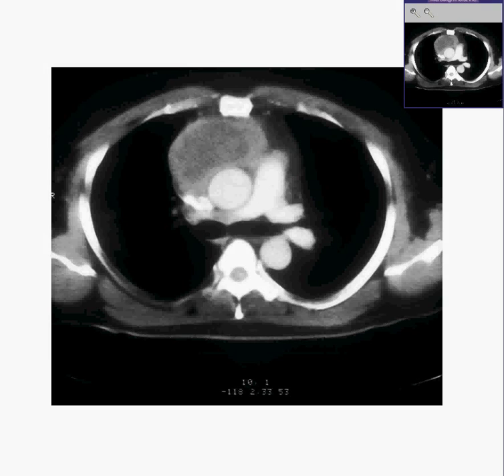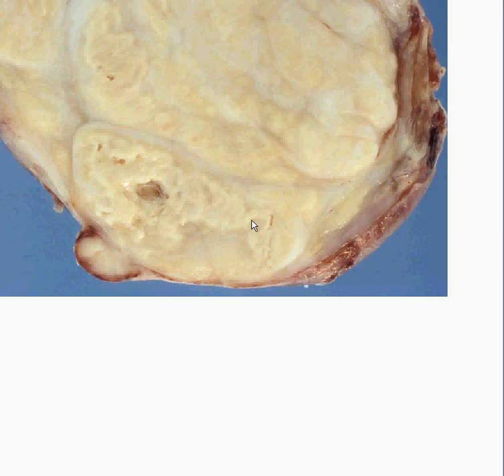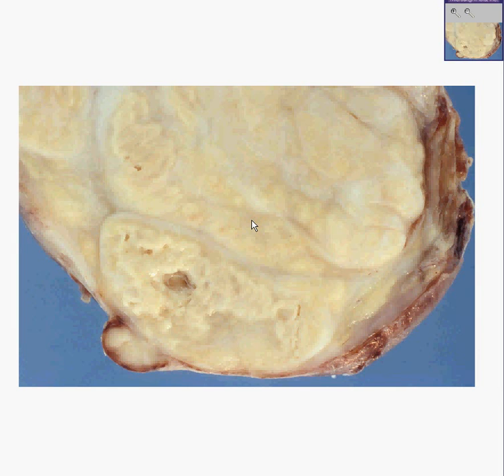Let's take a look at these lymph nodes grossly. We did the surgery, we cut through the lymph node, and look at the two obvious features of this lymph node. It has these nodules, and the nodules are separated from each other by thick bands of fibrous connective tissue. This is nodular, and it's also sclerosing. So, if I told you that this was nodular sclerosing Hodgkin's disease, you'd probably totally believe me, even if you didn't see any cells under the microscope yet. And indeed, a young person with mediastinal lymph nodes, which is nodular and has bands, is nodular sclerosing Hodgkin's disease until proven otherwise.